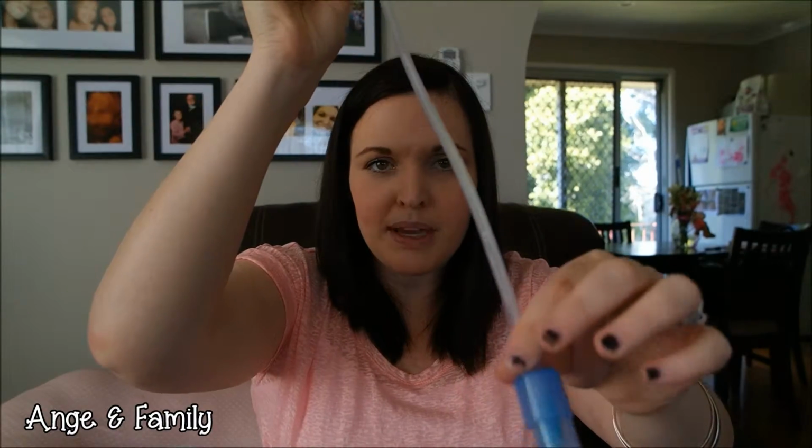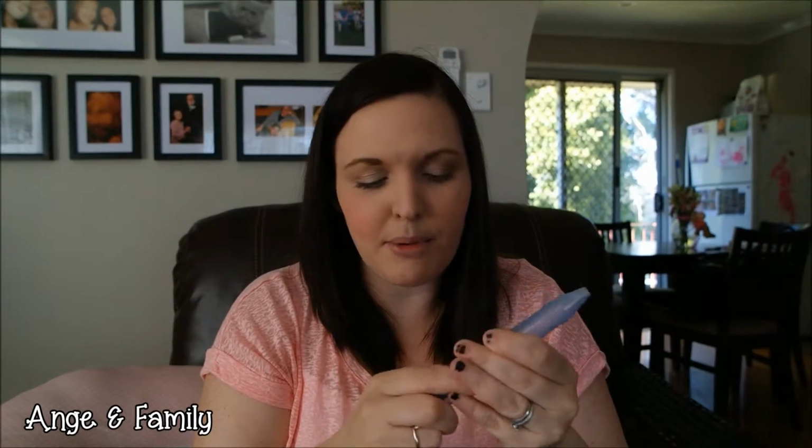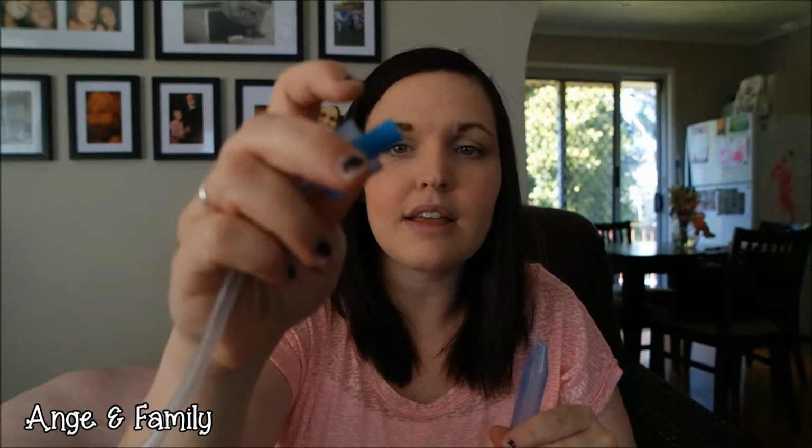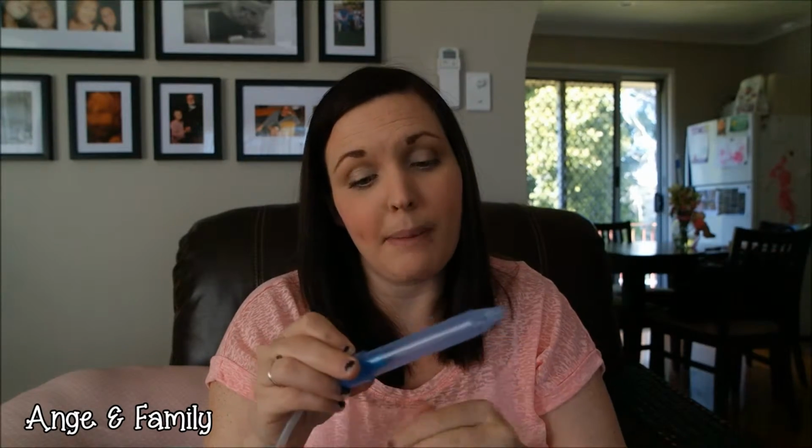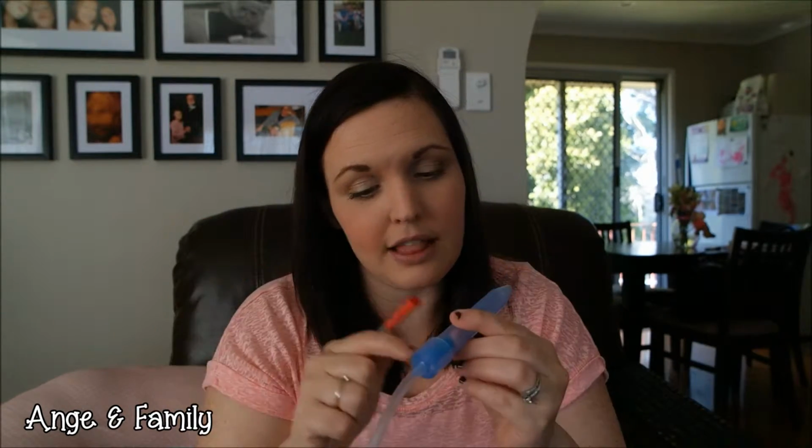So it does come in 4 parts. So it basically looks like this, and it has like a red little tubing here that this is the bit that you actually pop in your mouth and suck on. It then has this big long tubing, and it has the most important part here, which is the filter. So every time you use a snot sucker, you're meant to chuck that filter away and put the new one in. So basically that means that you don't get any snot transfer from your child into your mouth. So that's the most important part, and without it, basically it does become unhygienic. So you do need that little filter.